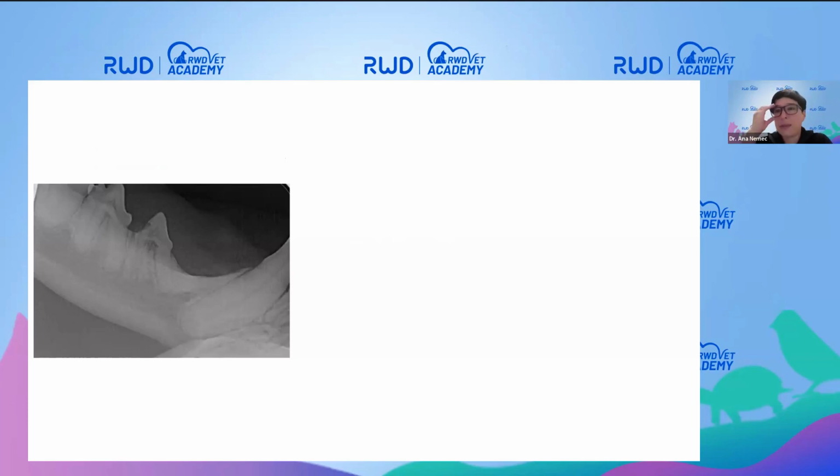In some cases, be very careful if you are deciding on crown amputation. And this is one of such cases. This third premolar tooth was obviously affected by tooth resorption. The mesial root looks like a clear type 1 tooth resorption. The distal root doesn't look that clear. It may even be type 2. So what do we do? We open up a flap for an extraction, a triangular mucoperiosteal flap, and remove alveolar bone like you would for an extraction over both roots.